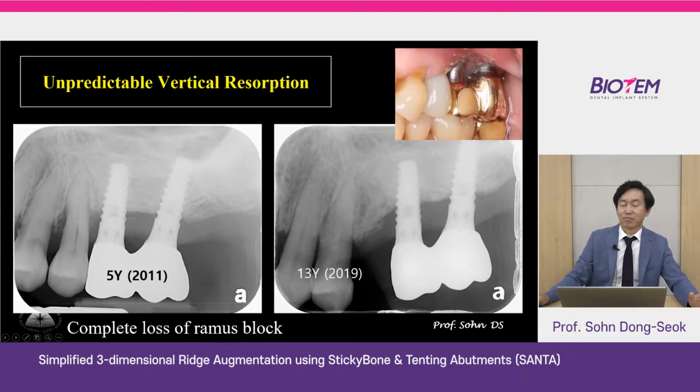After that, the implant was placed by her dentist. After 5 years in function, she came back to me for a follow-up. You can see the complete loss of the ramus bone.